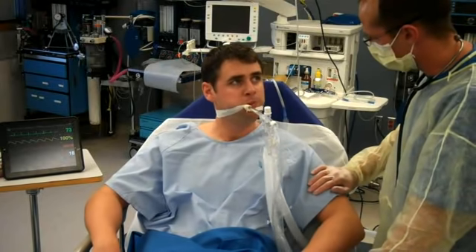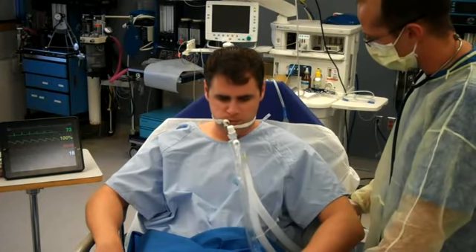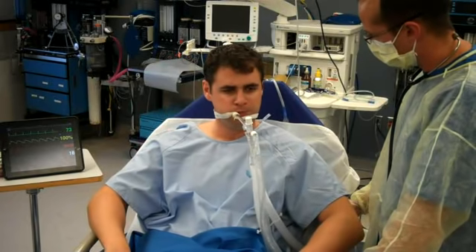Hi Mr. Simpson, it's Greg the R.T. again. How are you doing? So I just talked to the team. What we're going to do is we're going to take that breathe-in tube out. Does that sound like a good idea? It looks like you're doing quite well. You're breathing nicely by yourself, so we're going to take that out.